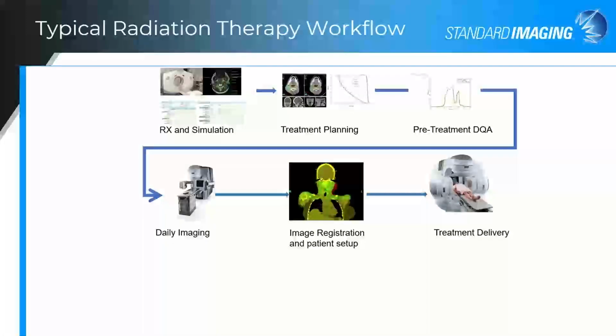And with that stated, let's talk about just a typical therapy workflow. I mean, this outlines just the basic steps. Today, with the complexity, there's even a few more items that you could actually put in this list. But everything starts with the basic simulation, some type of order, proceeds to treatment planning, and then pre-treatment QA, which a portion of Adaptivo will handle.